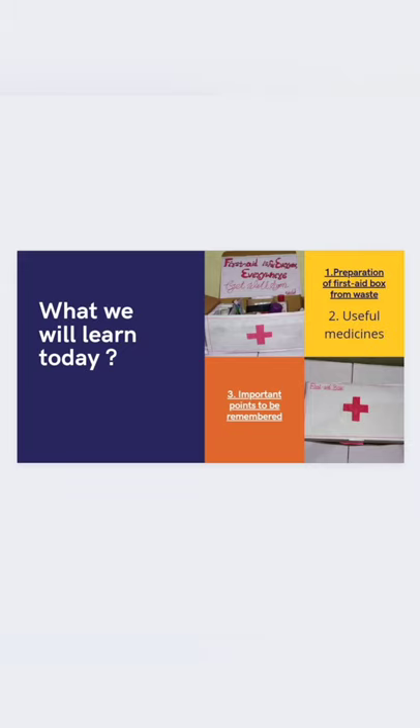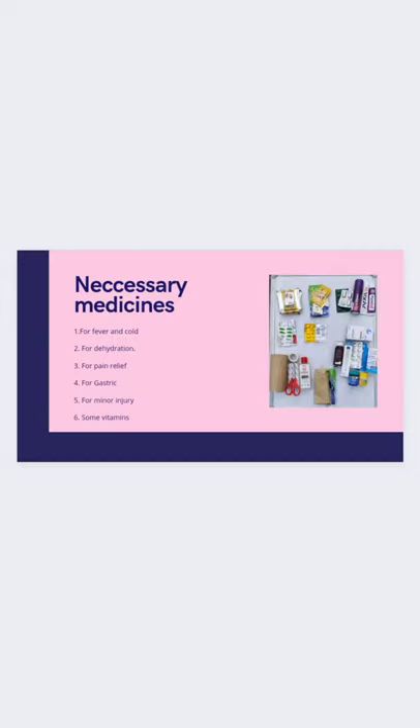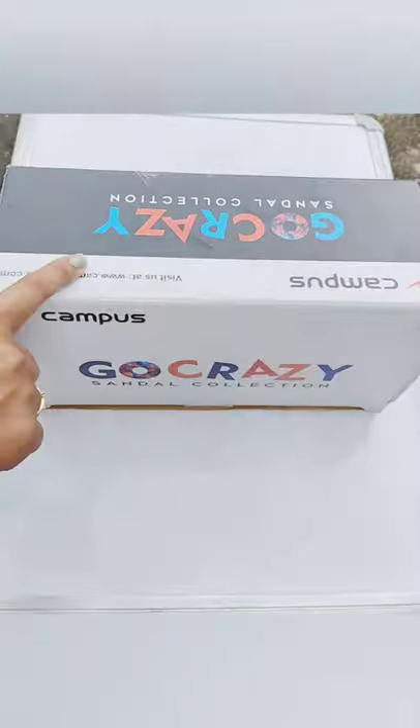So in today's lesson we are going to learn the preparation of a first aid box from waste materials, useful medicines, and important points to be remembered. For this we need two shoe boxes, white wrapper, a pair of scissors, black marker, ruler, glue, color papers, red sketch pen, and necessary medicines. Let's get started!